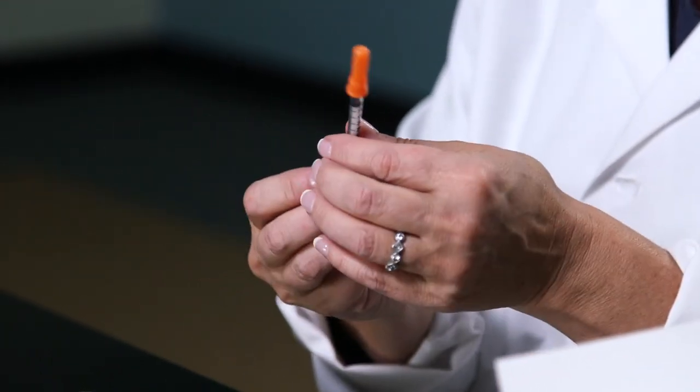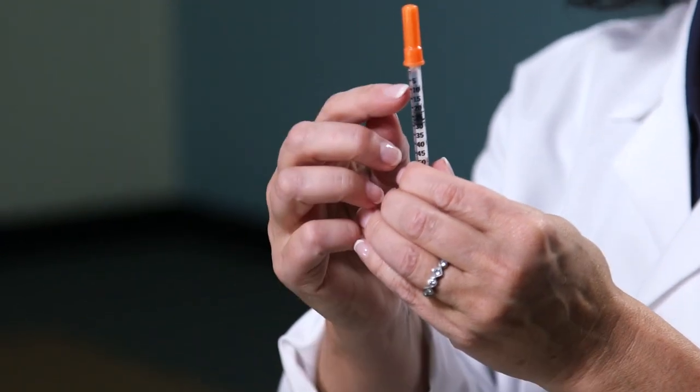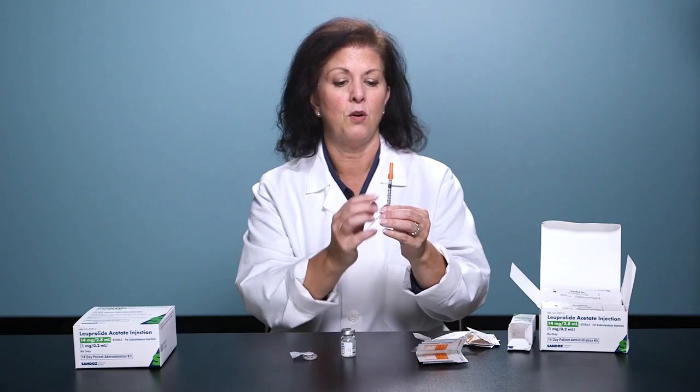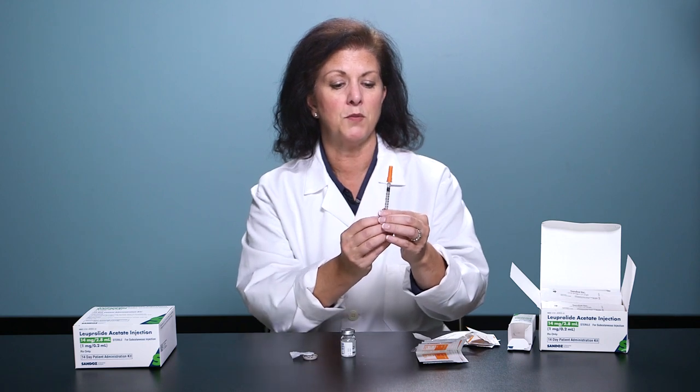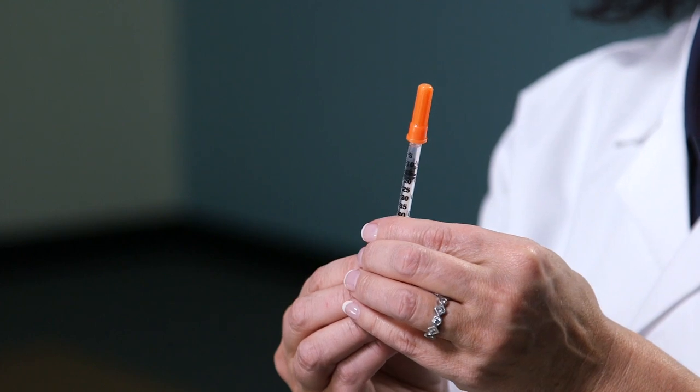Remove the insulin syringe from the packet. You'll notice that it's marked either 0.1, 0.2, 0.3, all the way up to 0.5, or 5, 10, 15, 20, all the way up to 50. Pull back the plunger to your prescribed dose.